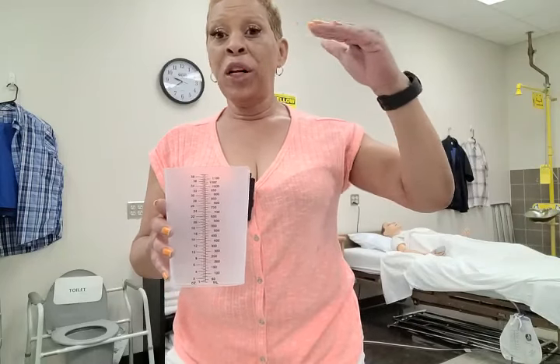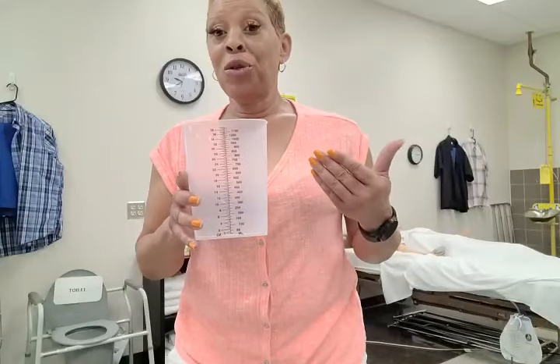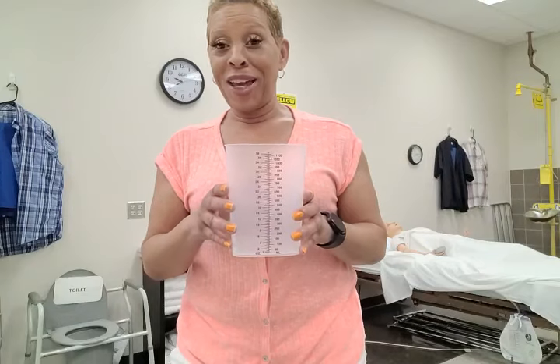When you measure, if the urine is — let's say it's in between 100 and 125 and it's like in the middle — you want to round up, so you would record 125 milliliters. Or let's say your measurement was between 150 and 175: again, you round up and you would record 175 milliliters.